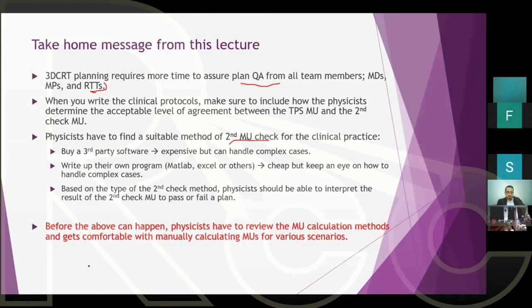I listened to reports of the AAPM. One of them is talking about this. I summarize it here, which is how to handle discrepancies of monitor unit calculation and the errors that could happen. And the other report is basically about MU calculation methods. It starts with simple things and then you go into more and more. And they have the whole brain case. I'm not sure if they have the breast. It's been a long time since I saw the report. But I know they have the whole brain case, how to do MU calculation for it.